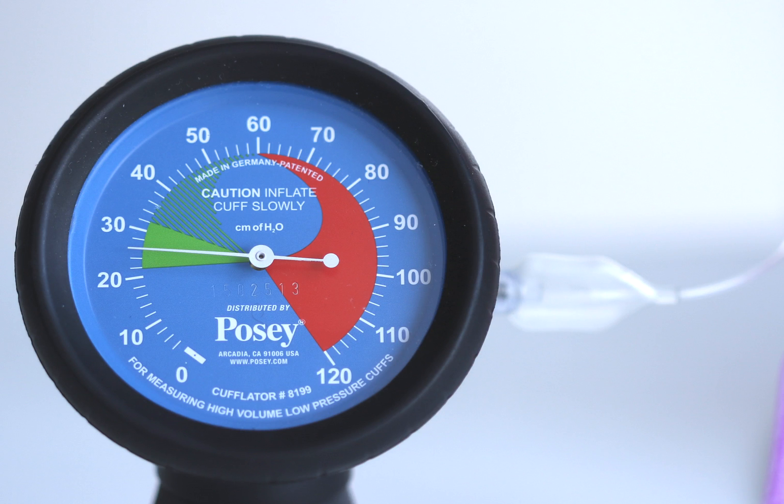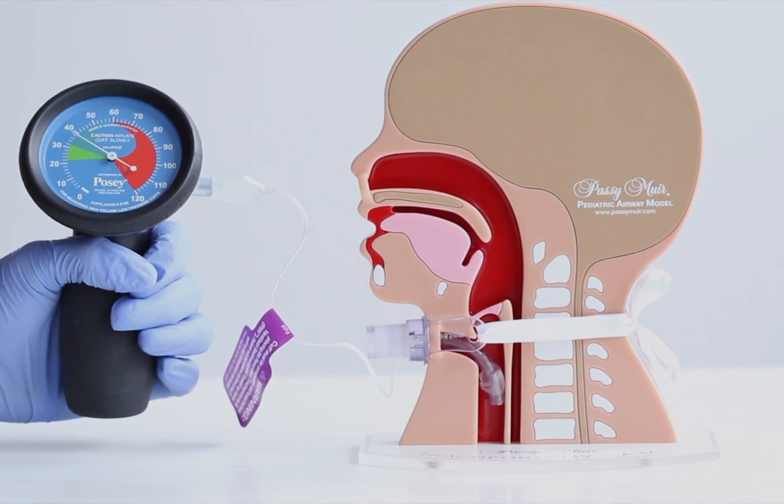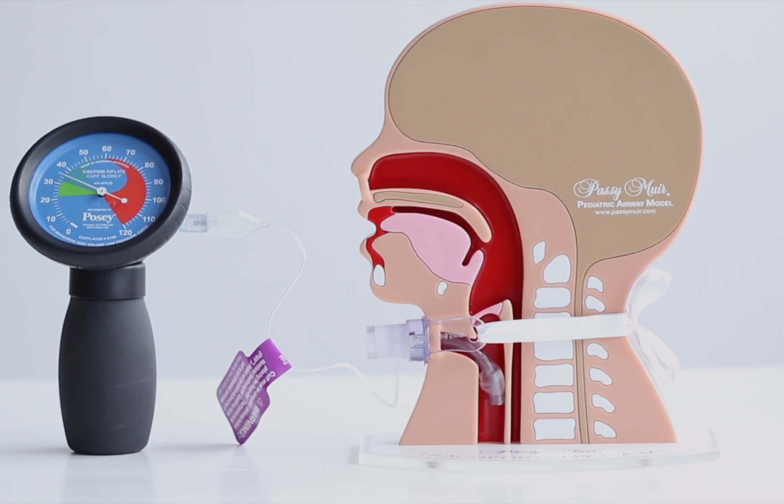To measure the cuff pressure, attach the manometer to the pilot balloon of the tracheostomy tube and note the needle on the manometer that will reflect the measured pressure. Recommended cuff pressure is highlighted in green on the face of the gauge. Continue squeezing the inflator bulb or releasing air as needed to ensure the cuff is inflated properly.